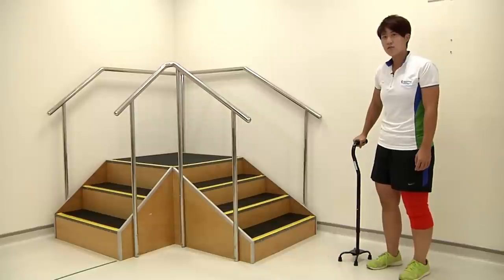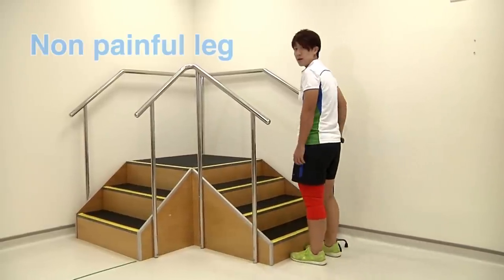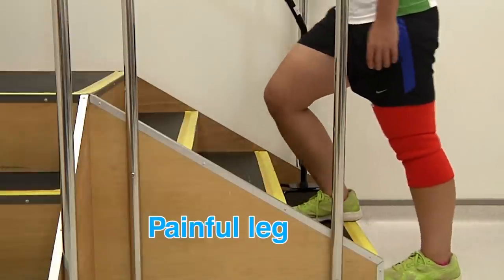To go up the stairs, move closer to the base of the stairs. Step up with your non-painful leg, followed by the stick as a support, and then your painful leg.